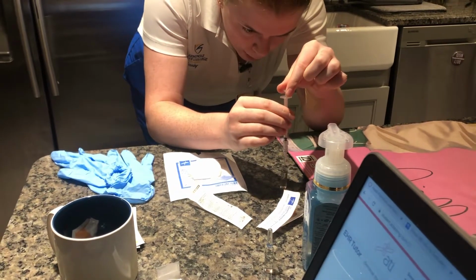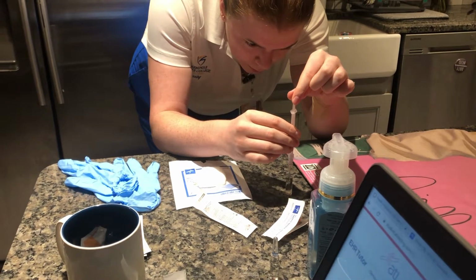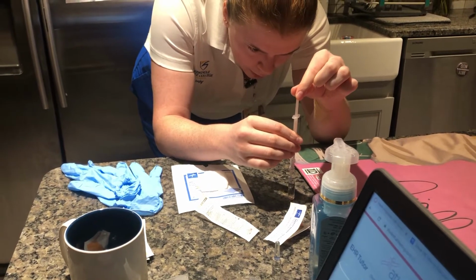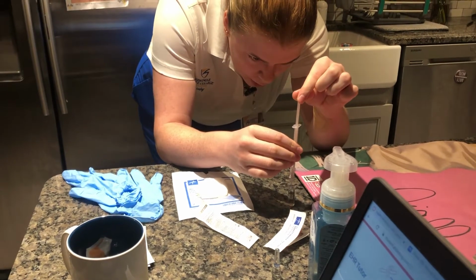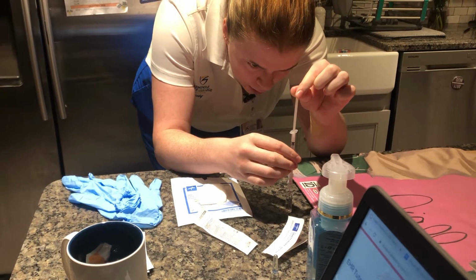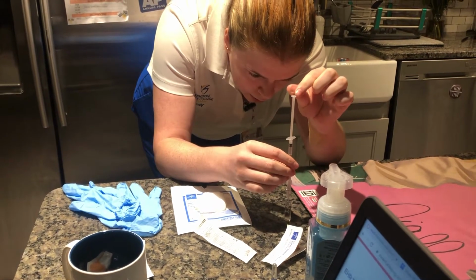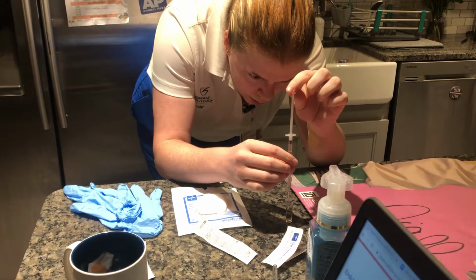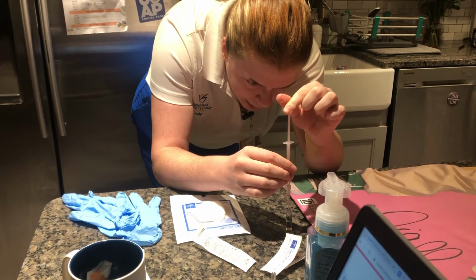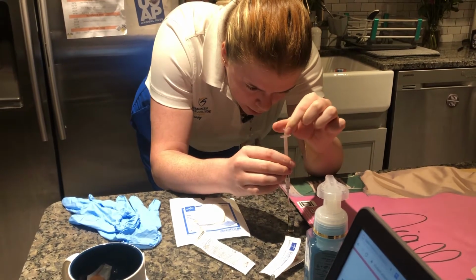I'm going to go ahead and pull up as much as I can. So I gotta fight with it. It's got some little air bubbles.